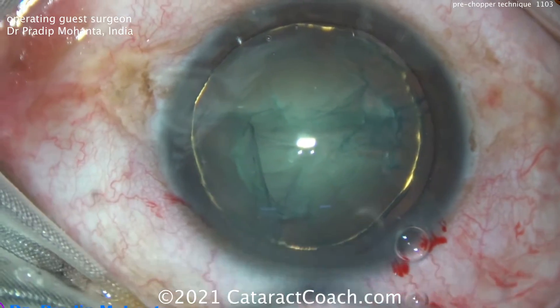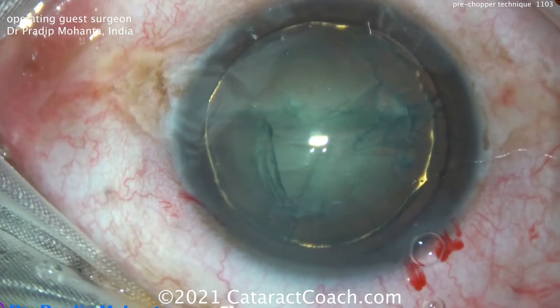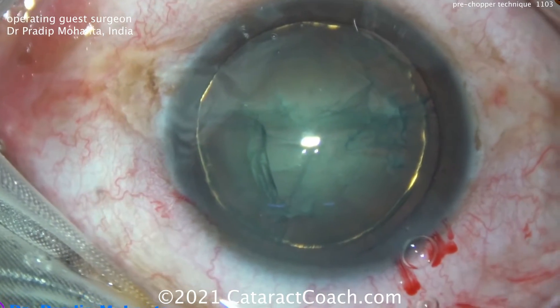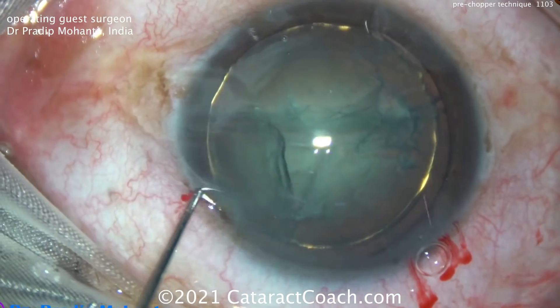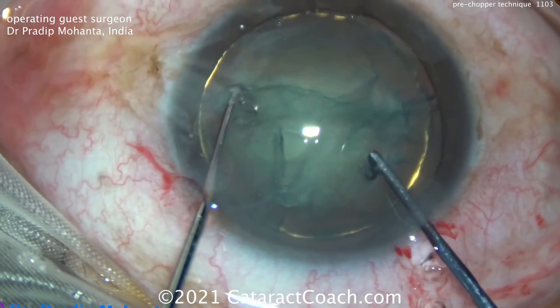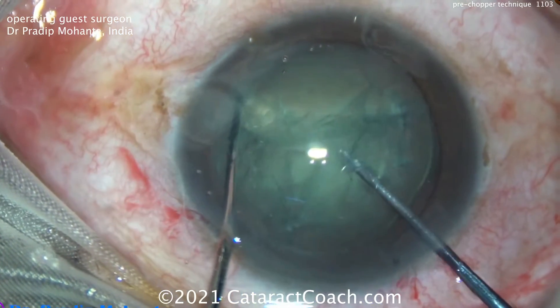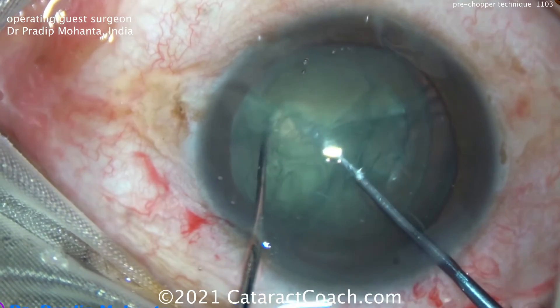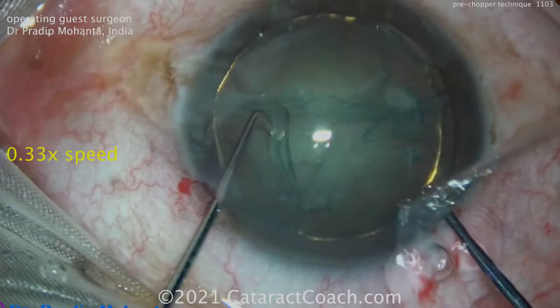Here's the cataract. Rhexis has been done, hydrodissection and delineation have been done. Look at that chopper — look at the design of it. The tip is sharp. It's meant to be pushed into the nucleus sub-incisionally and then moved towards the chopper. Notice carefully how the nucleus itself won't move. Two instruments come together, that chops the cataract, and then you pull it apart and split it. Just like that.